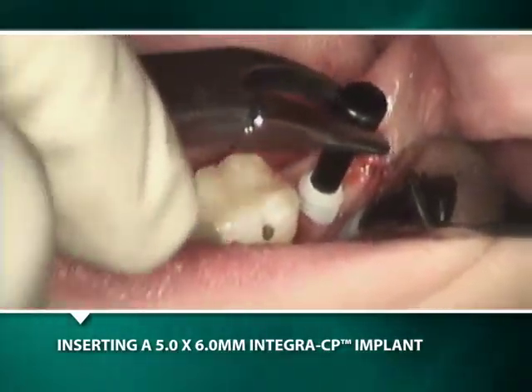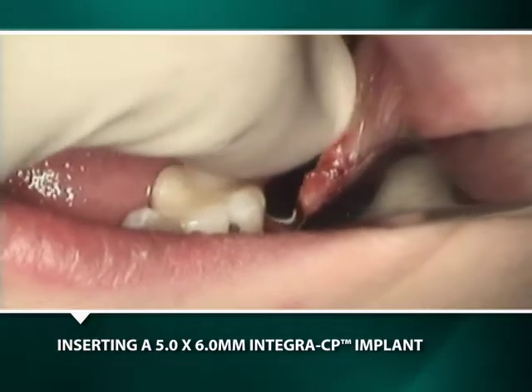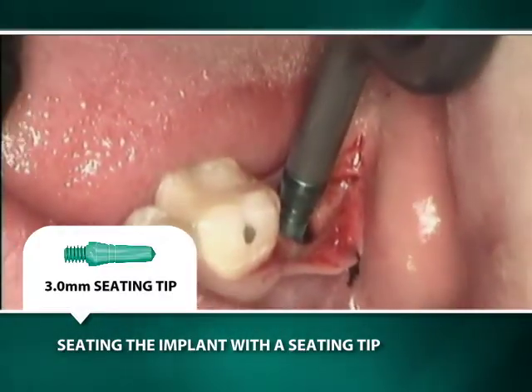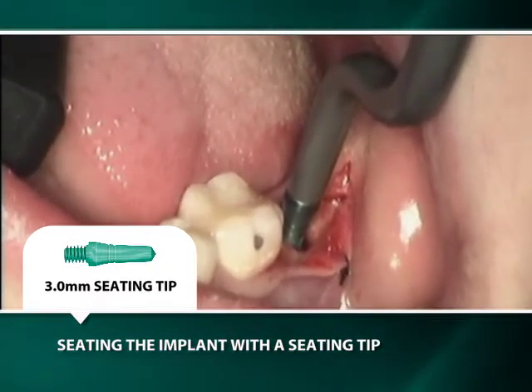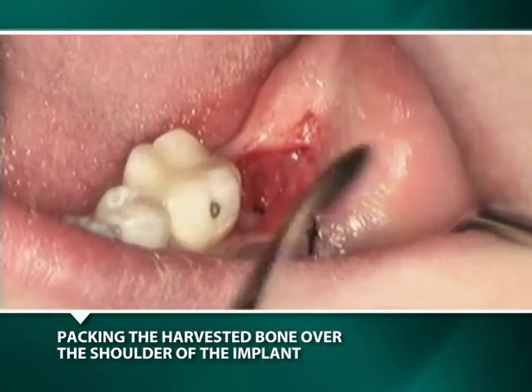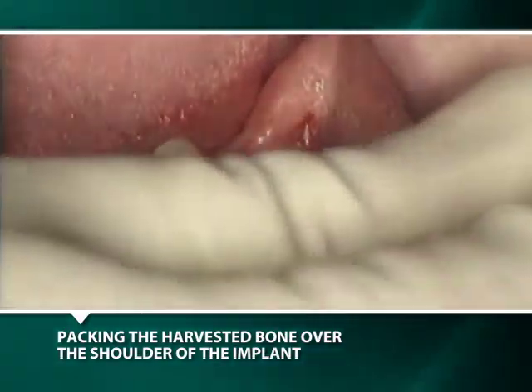The implant is transported to the osteotomy with a black healing plug and is then twisted and wiggled into position. The black healing plug is removed and a green 3 mm seating tip attached to an offset driver is inserted into the well of the implant prior to its being definitively seated with gentle taps. The cut healing plug is transported to the well of the implant on the tip of the periodontal probe. Harvested bone from the preparation of the osteotomy is placed over the implant and healing plug so that the healing plug is ever so slightly visible.